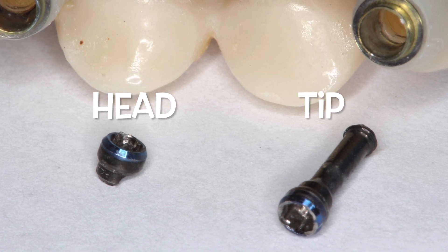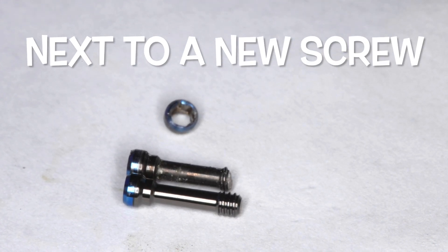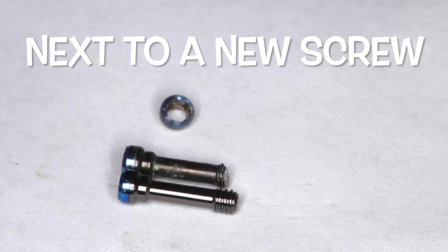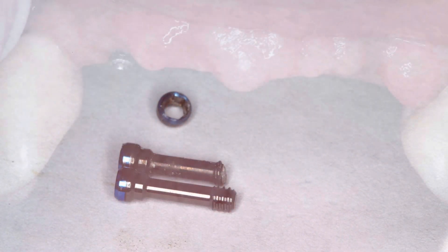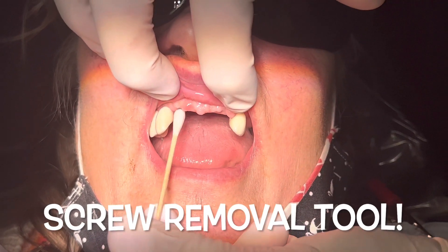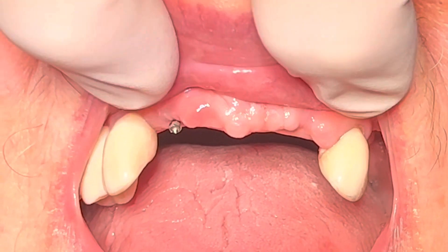Putting new screws in is not a big deal, but we have to think long term about protecting this. Here's the original screw — you can see how much of the tip is gone, just a very small amount. The screw will typically fracture at the head if there's too much force, and after the bridge rotated, the screw on the other side started to fracture just like work-hardening a coat hanger — you bend it back and forth.